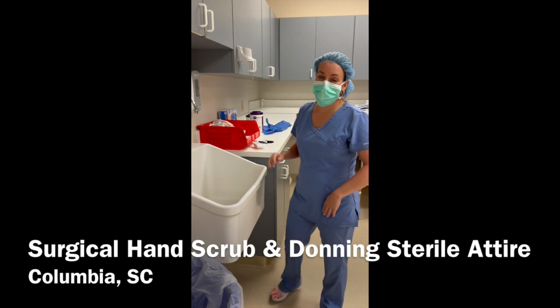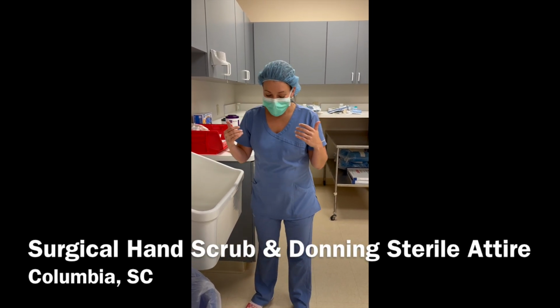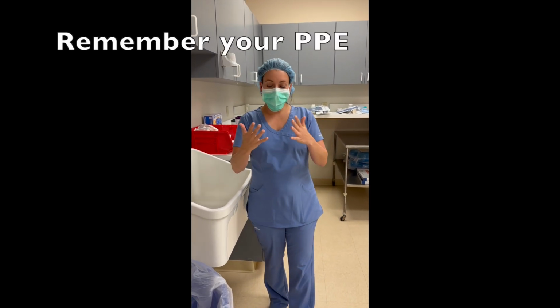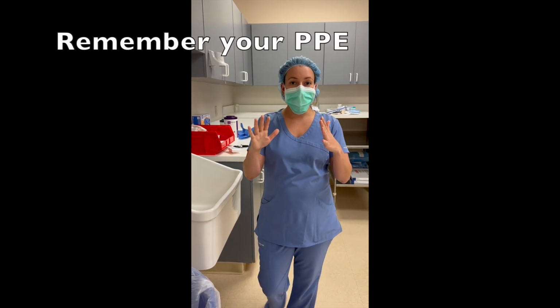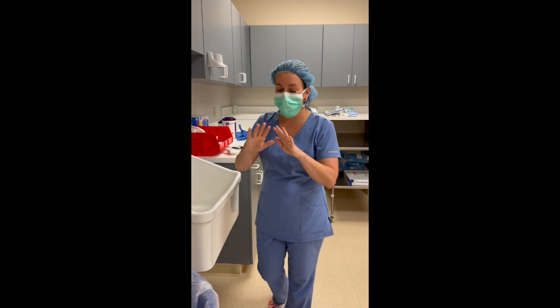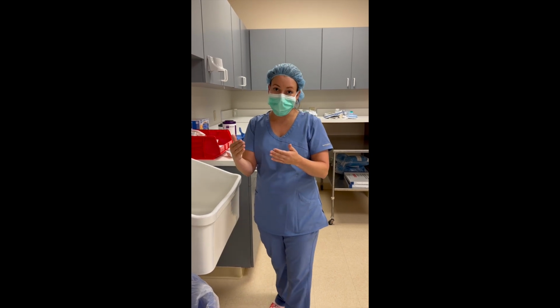So now we're gonna go over surgical hand prep. The main thing is that I have my hat and my mask on and potentially my shoe covers. I don't in this video, okay? But that I don't have any jewelry on. No necklaces, no rings, usually no earrings, but I do in this video. No watches or anything like that, because I'm getting ready to go into a sterile environment, okay?